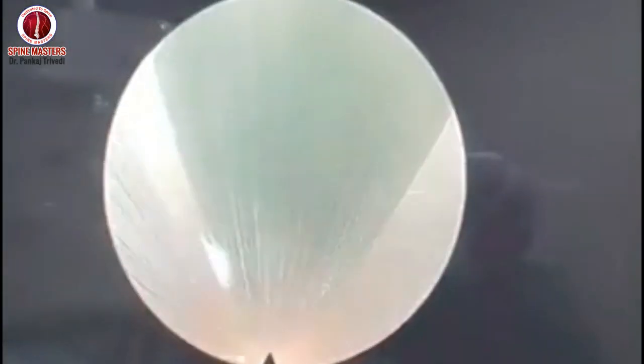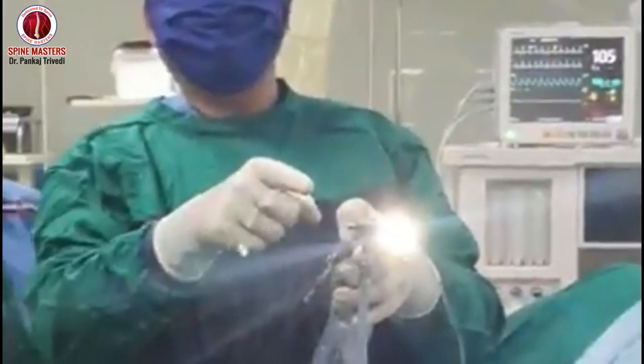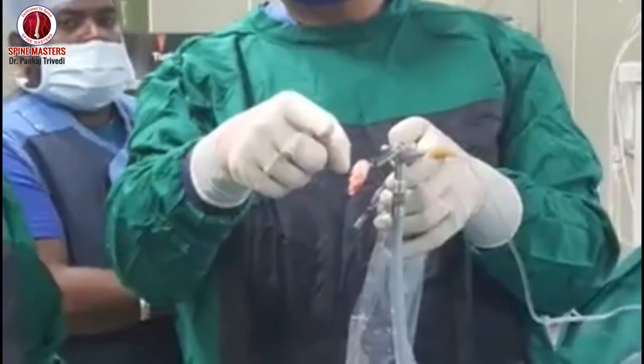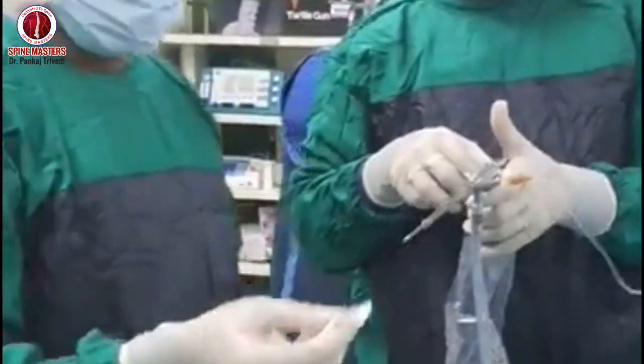Now I think I have got a catch. Let's see what comes out, and a surprise. Wow! Here comes the culprit. Now you can see such a big disc fragment, the downside migrated disc, and it is out. Now you see, this is the whole fragment. It was like this, downside migrated. The whole fragment is out. So that is the beauty of the endoscope.